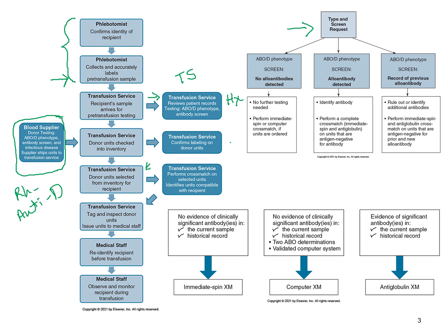Now just because an antibody screen shows up negative at this point does not mean that, let's just say the patient previously had an anti-JKA, because we know those kids like to hide and play games and all of that. If the patient previously had an anti-JKA in the history, but it's not showing up now, you still have to honor that. So this is where this comes in here. Let's just run through each of these.